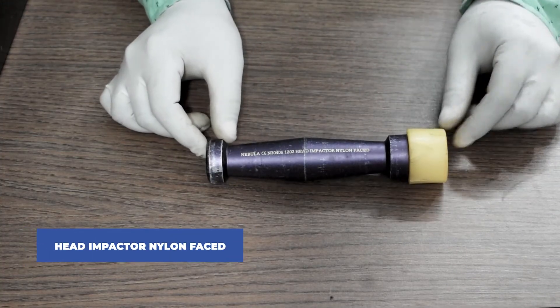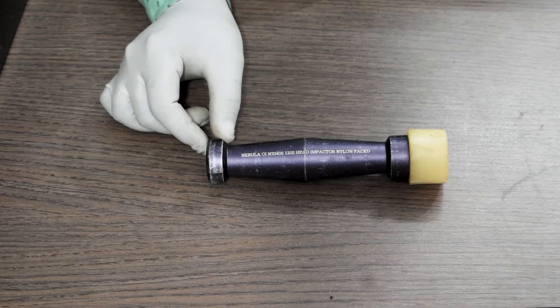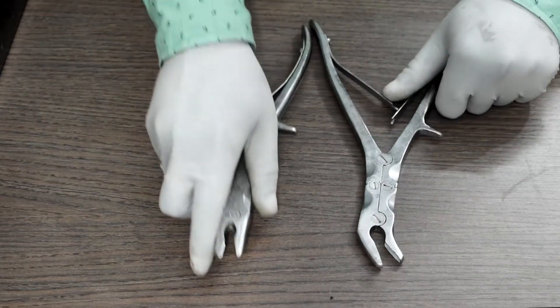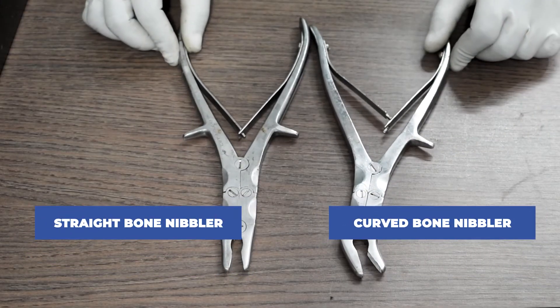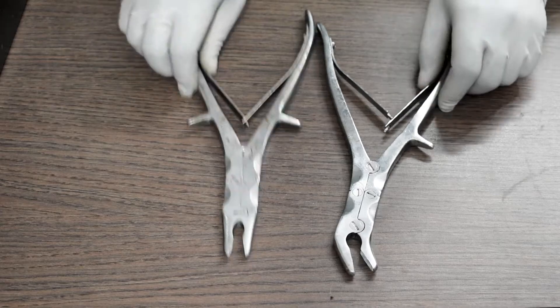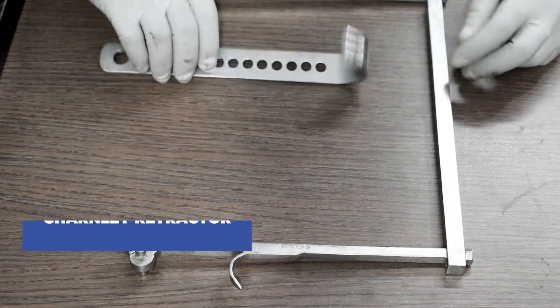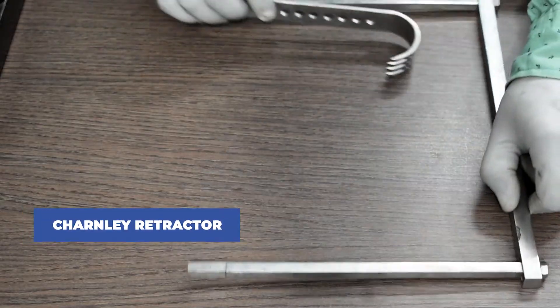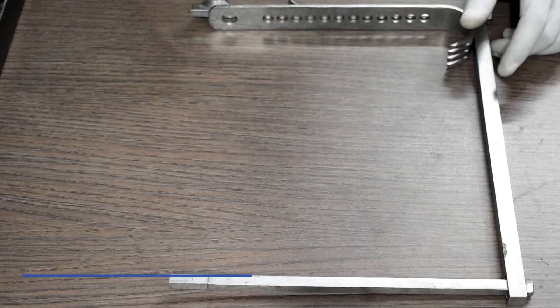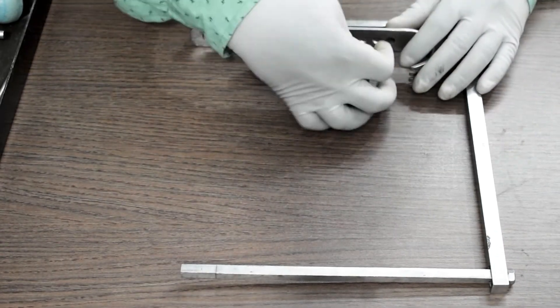This is called a head impactor, nylon faced. These are bone nibblers — the one on the left is a straight bone nibbler and the one on the right is a curved bone nibbler. This one is called a Chandler retractor. This either comes in solid or in parts which you can assemble together, depending upon the company.